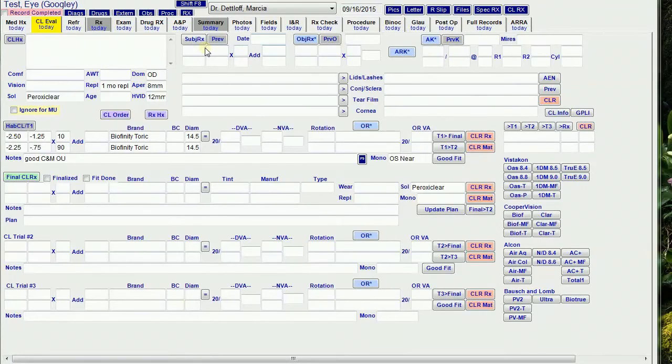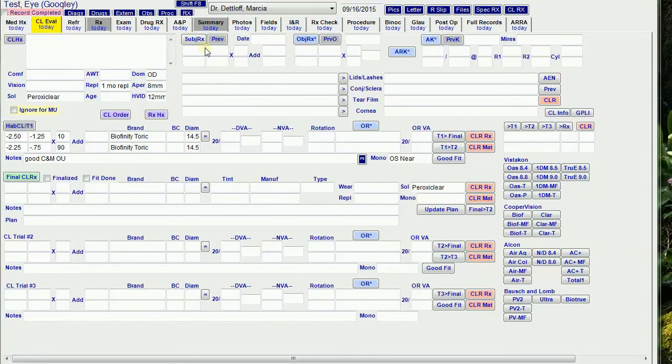When I finalize the Spectacle RX, it puts the subjective RX here, not the final RX, because sometimes the final RX is modified, and I wanted to know what I actually got in the phoropter.